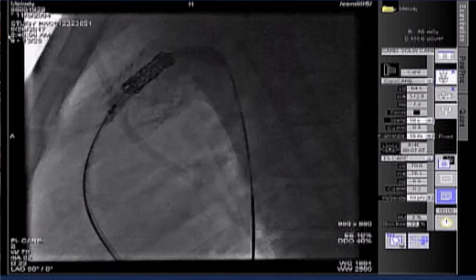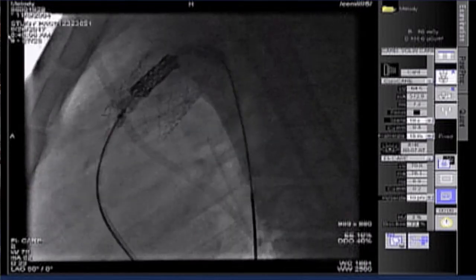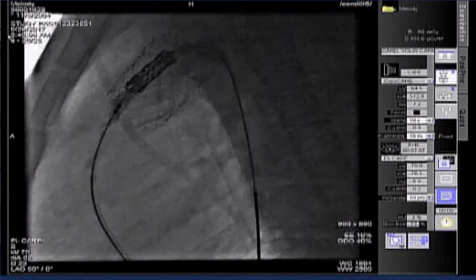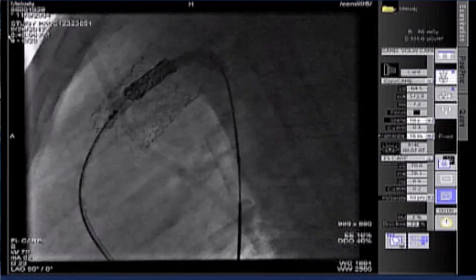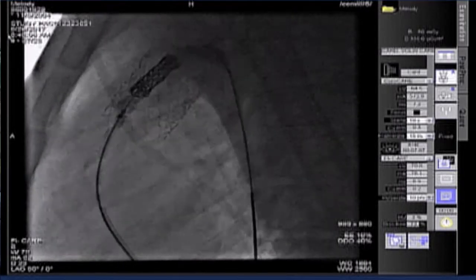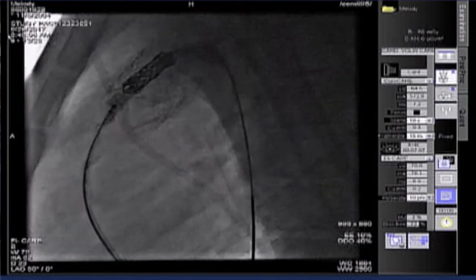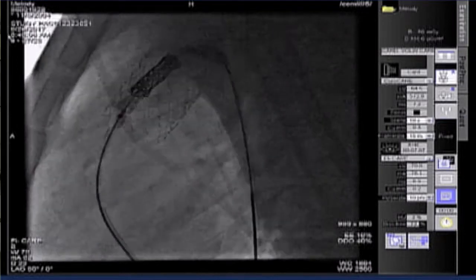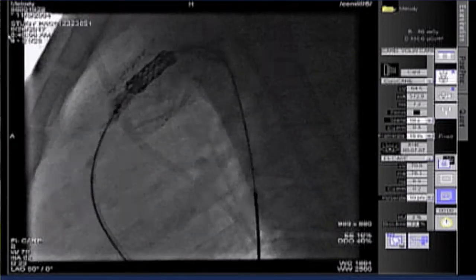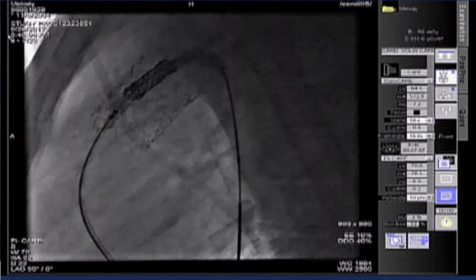I always agree with myself where to put the stent, and I aim to deliver it within the millimeter that I intend to. So this is just pulling it back. I must say it went rather easy, not difficult at all. The fact that it was double folded didn't matter too much. By the way, when I repositioned the melody and covered it again, that went very smooth. So once it is well crimped, it goes easy.